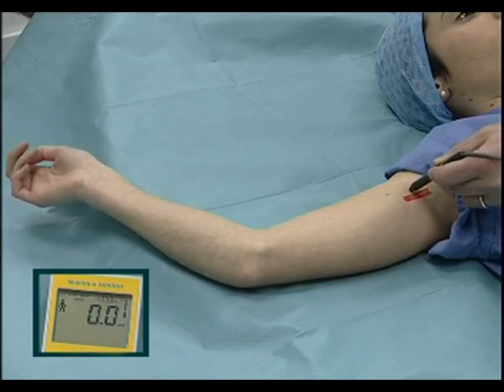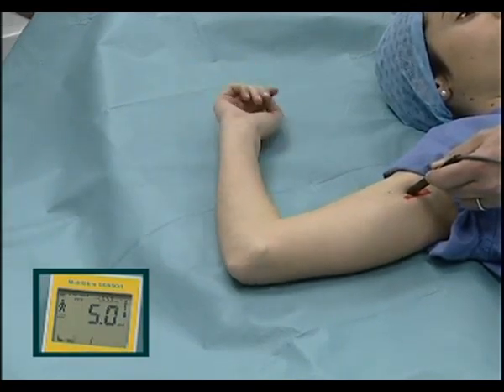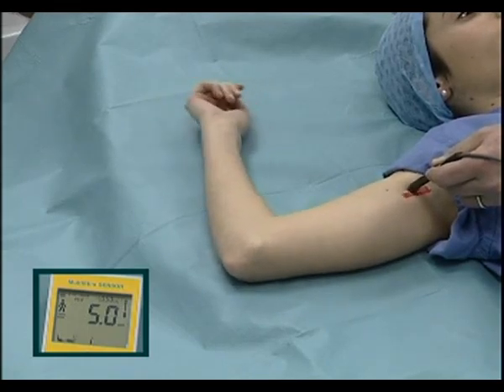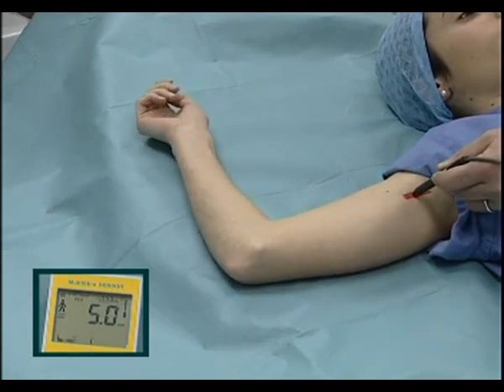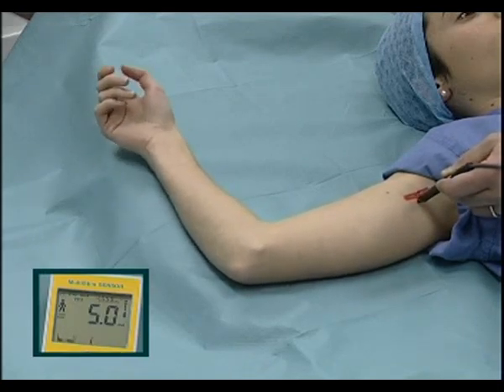We can now see musculocutaneous nerve stimulation, elbow and wrist flexion, and forearm supination, followed by ulnar nerve response, wrist flexion, medial finger flexion, and thumb adduction.